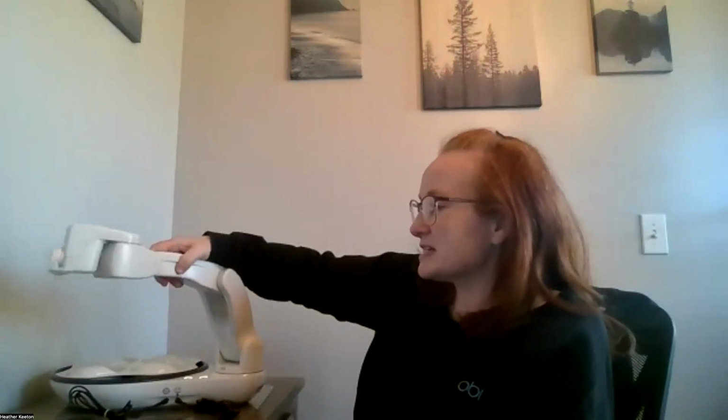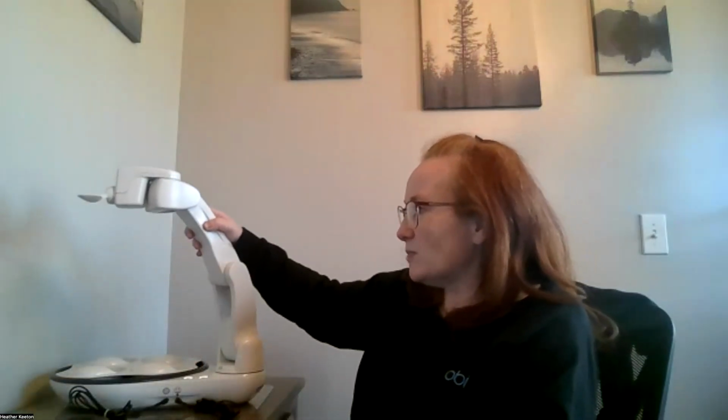Perfect. And then is there anything we should know about in terms of positioning, like how far it can go, that kind of thing? Yeah, so as far as Obi goes forward, it goes approximately 9 to 10 inches forward, and can almost go straight up.